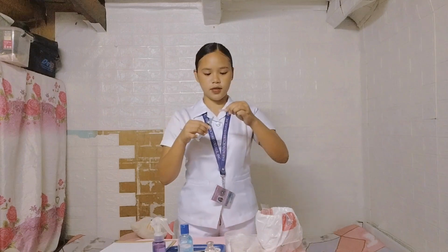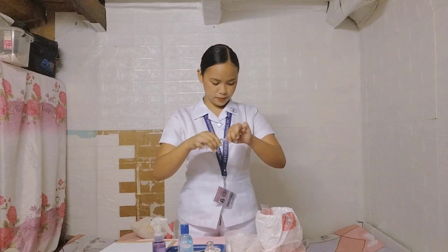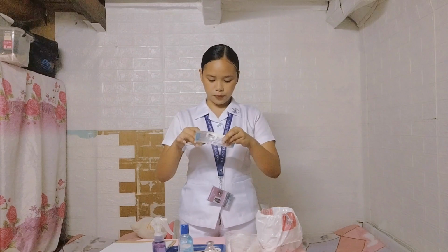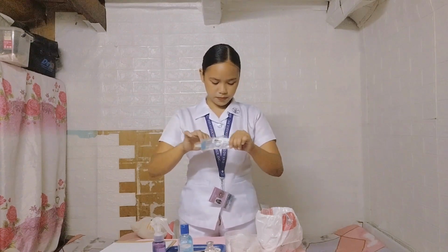Then take the aspirating needle off and connect it to the appropriate needle. Discard, then connect to the appropriate needle. Then discard. After that, place the medication card on the hypodermic tray with the corresponding drug.